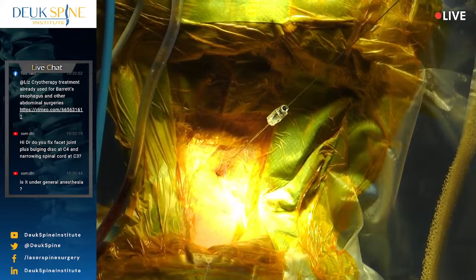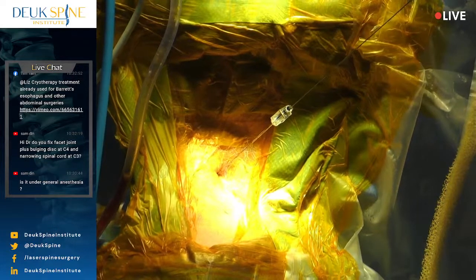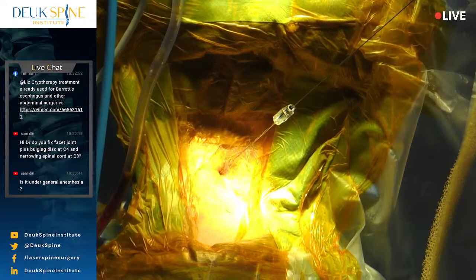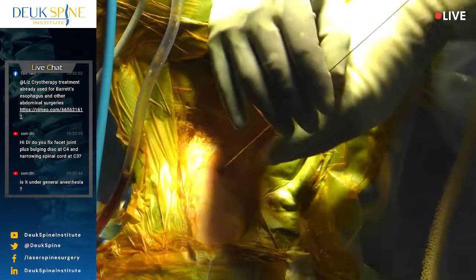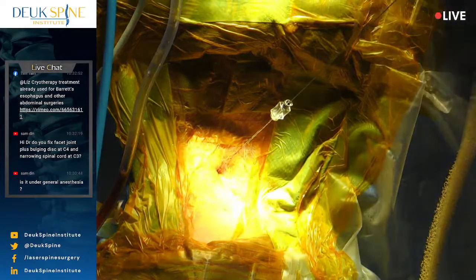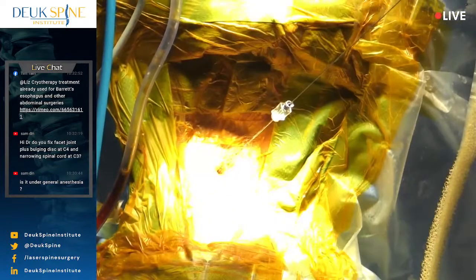Okay, 2, 3, 4, 5, 6, 7. Everyone agree? Why does it look a bit blurry? Can you take one more picture? That's better. That's better. All right. So I'm going to advance the guide wire, and I want to get another picture. And I'm going to advance it a little more. That should be good. Shot.